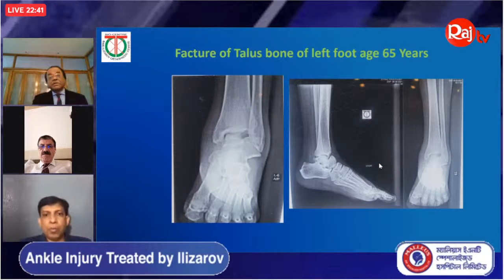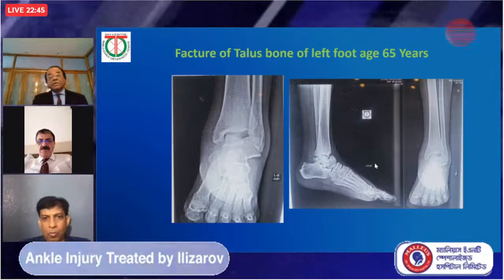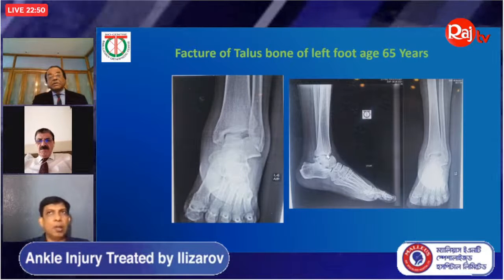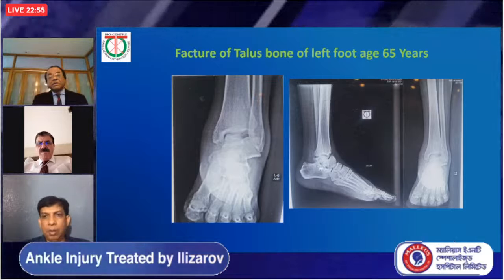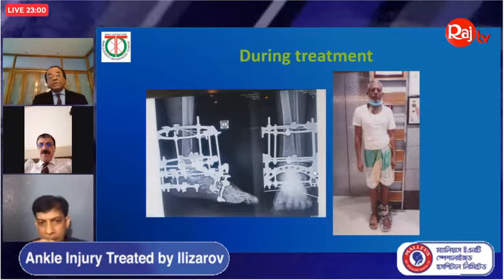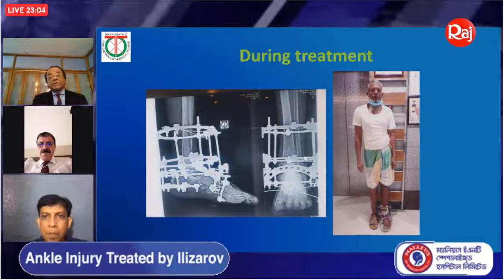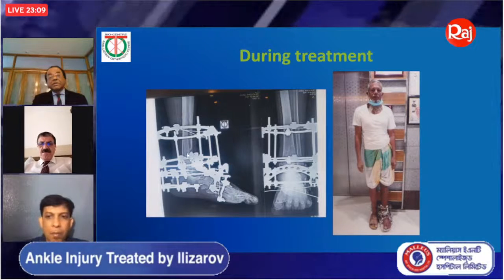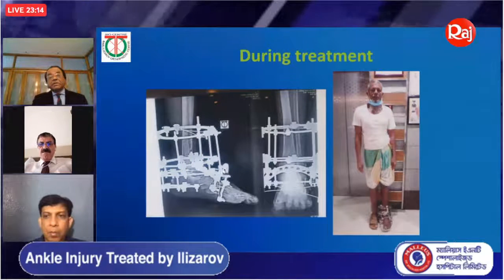So now sometimes you'll see a lot of talar bone fracture. Look at this talus. This is the fracture of the talus. See, at the age of 65 years. So these are also difficult problems, how to treat all these kinds. Now what I have done, you can see, the operation that I have done here. Again, one ring here, one ring, distal tibia 1 block, these 2.